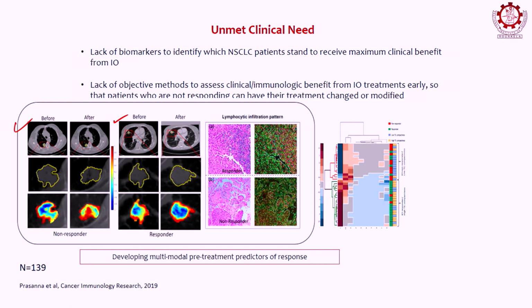They look so similar to each other. If you look carefully, you will see that the lung lesion is here and the lung lesion is right here, okay? And the sizes are similar, the texture just by looking at it looks similar, the intensity looks similar.